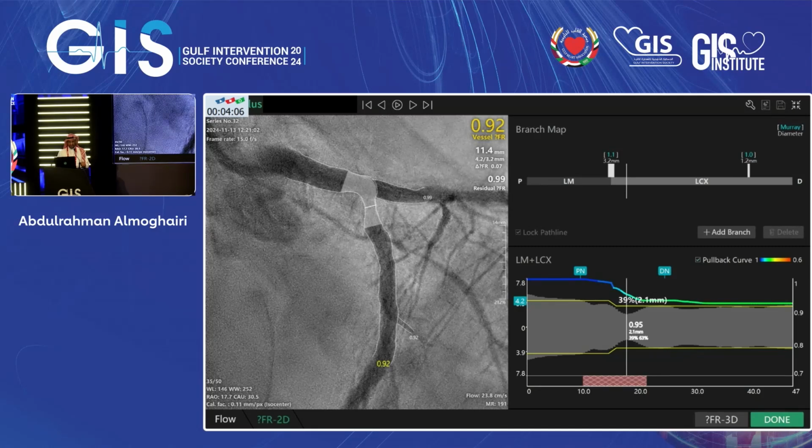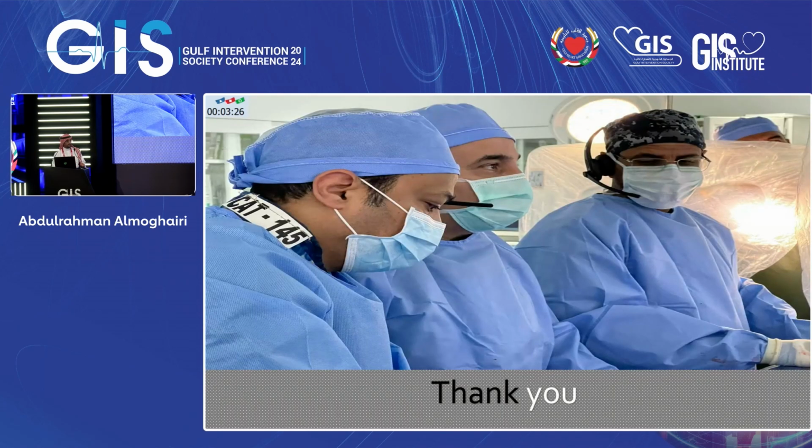And we repeated the QFR again. So it's the quantitative image plus the physiology combination, and we repeated the study pre and post intervention, and the result is as we see. So it emphasizes the role of using the different imaging modalities to support the diagnosis and also to optimize the therapy for the intervention. And thank you.